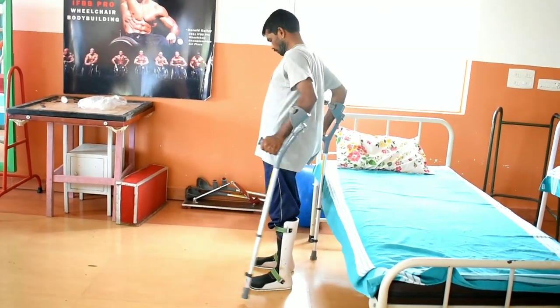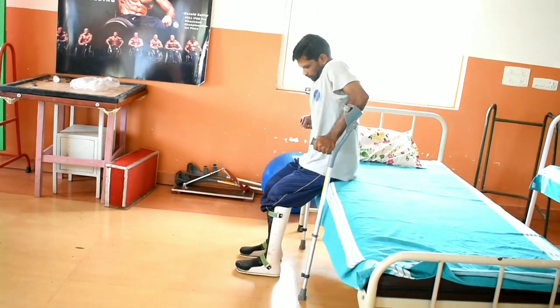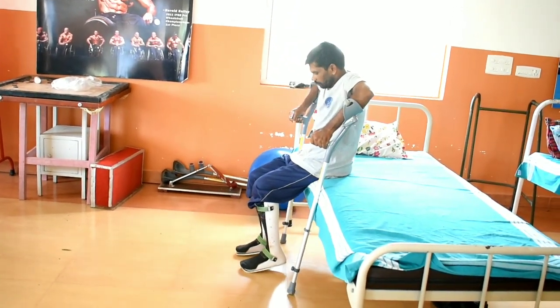Comparing both options, elbow crutches are safer and allow more independent transfers compared to axillary crutches.